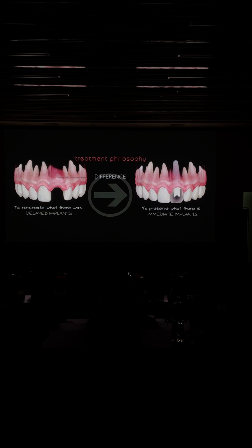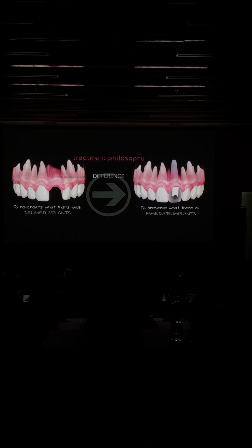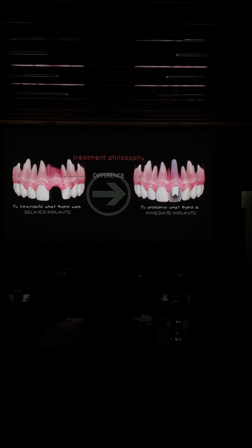The most important for me when it comes to recreate what there was, either with bone or with soft tissue, for me, if I have enough buccolingual bone to place an implant, if I have 4 millimeters of buccolingual bone, I don't do bone grafting. I compensate the volume with connective tissue grafting.